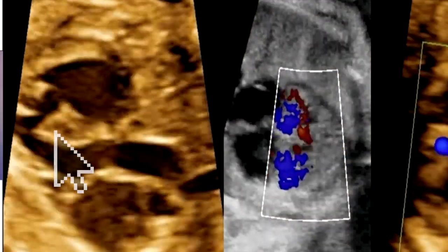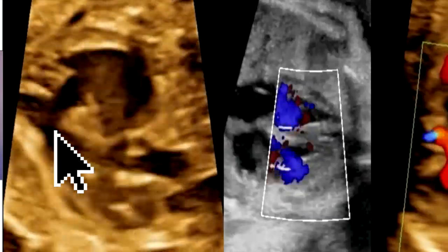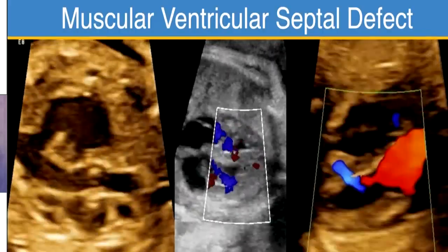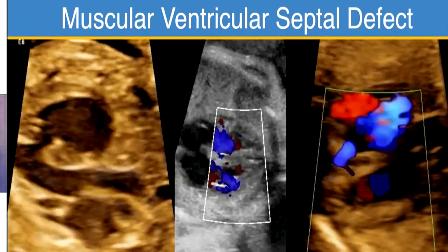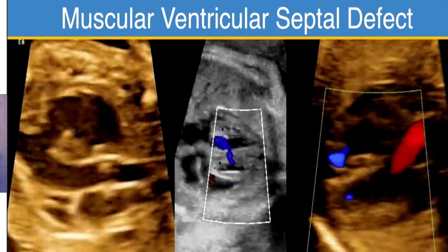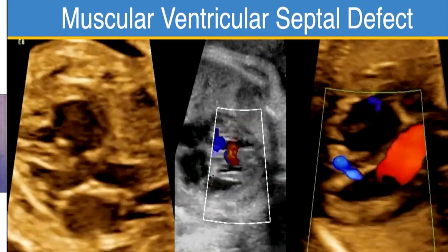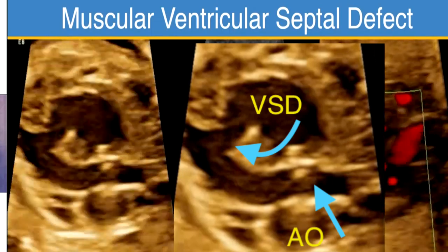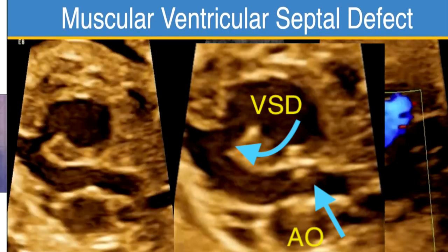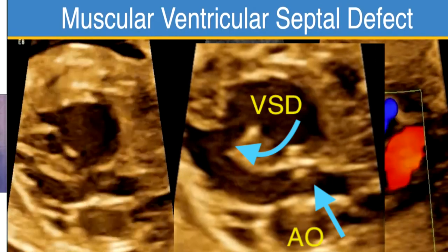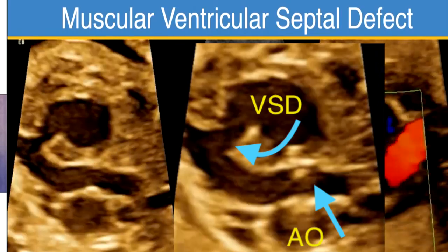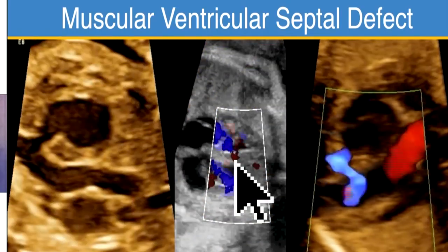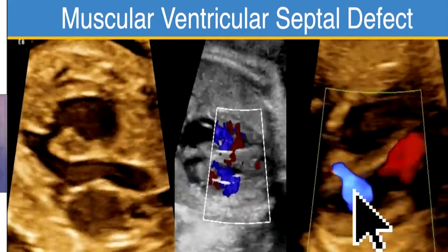Here are more examples. This one is quite large. When assessing size, I don't use absolute numbers — I compare the VSD to the aortic valve annulus. Here the VSD is greater than half the size of the aortic valve annulus, making it a significant, large muscular ventricular septal defect. This next one is much smaller.